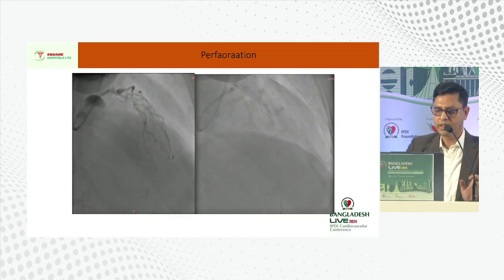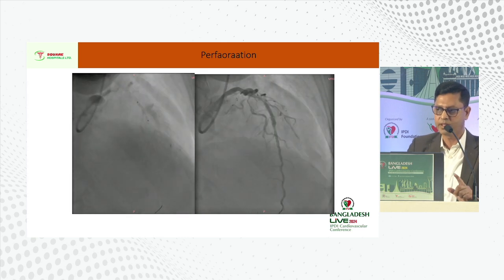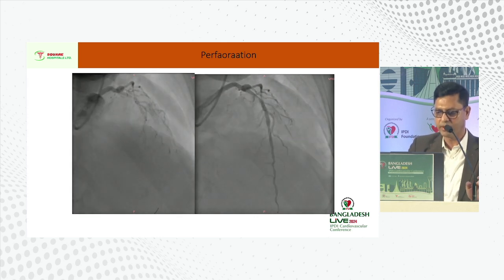And now you can see here the perforation. Actually, this case happened just the day before yesterday in my lab also. And we minimized the lesion, that is the perforation, by using the covered stent and then put another stent.